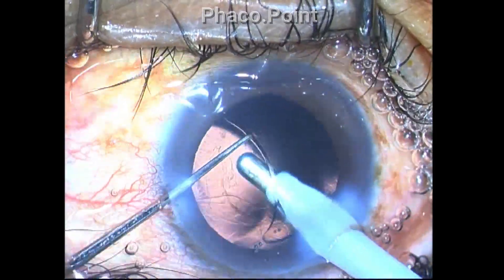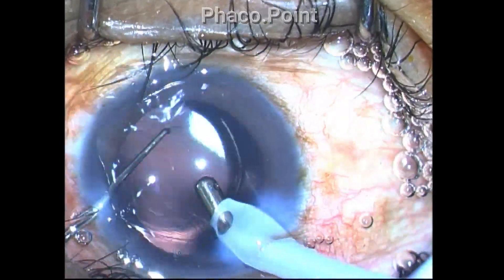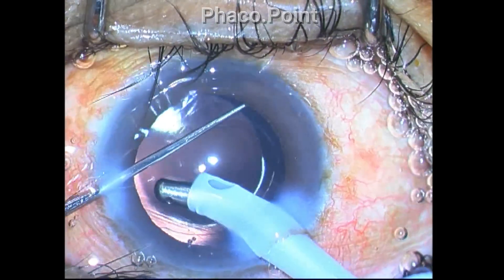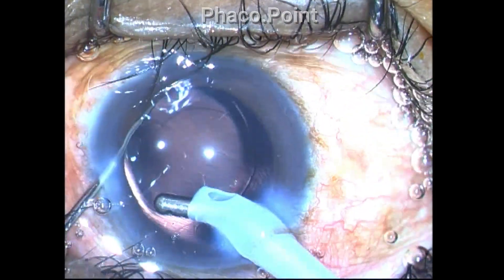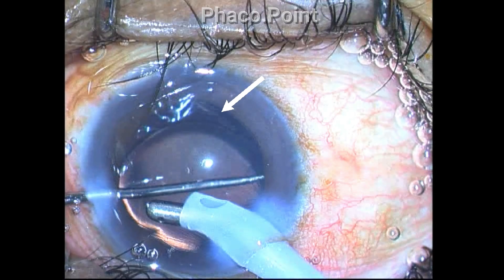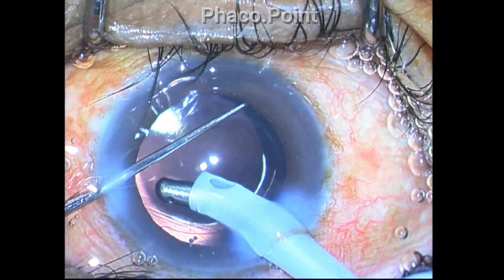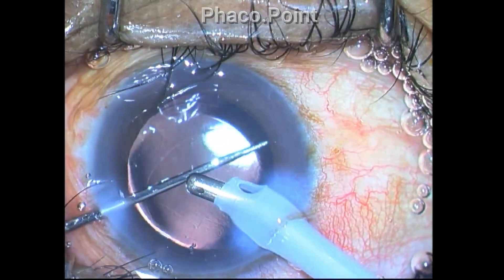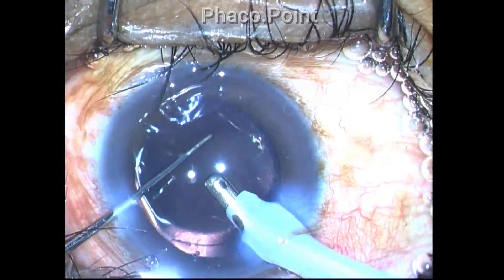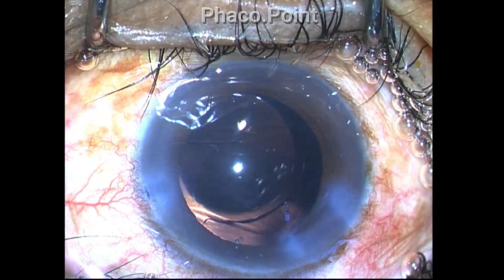I forcefully turn the lens slightly. You can see that when I rotate the lens, there is an abnormal flash of reflex — seen here in slow motion. Is it a zonular dialysis or is it a posterior capsular rent? I was not sure about what exactly the problem was because it happened so suddenly. However, when I came out of the eye, I found that the intraocular lens was decentering inferiorly.